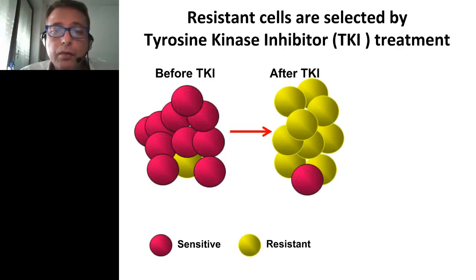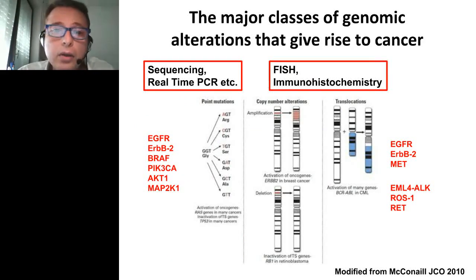For example, for advanced non-small cell lung carcinoma, in most cases we have available very little amount of tissue, and it will not be possible to perform all the analyses that are listed in this slide in the majority of the cases. This is why the cancer comprehensive centers are now trying to implement in their clinical research setting new platforms, high-throughput platforms, in particular genotyping platforms and next-generation sequencing approaches.